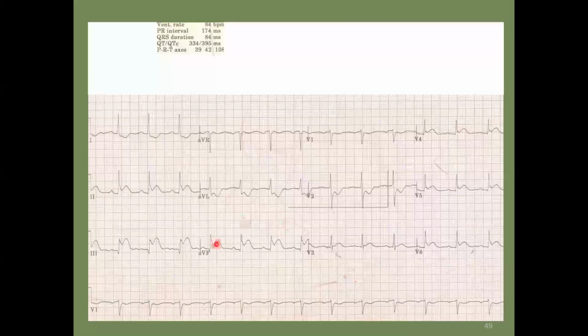All right. And here, what I want you to see is your ST segment elevation. Look at this. You may have heard people talk about fireman's hats. If you look at the fireman's hat from the side, this is the plate, and then this is the main part of the hat going down. You've got ST segment elevation in 2, 3, and aVF. That tells me that it's an inferior wall MI. And then I have what's called reciprocal changes over here and over here. That tells me that this is a pretty fresh MI, because reciprocal changes you'll only see usually within the first 2 hours of the onset of symptoms. And then the reciprocal changes may disappear and you've got ongoing ST segment elevation.